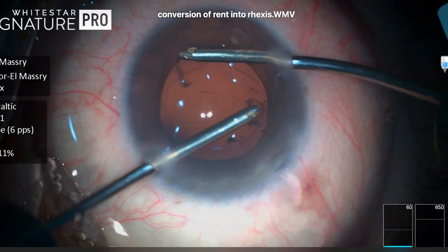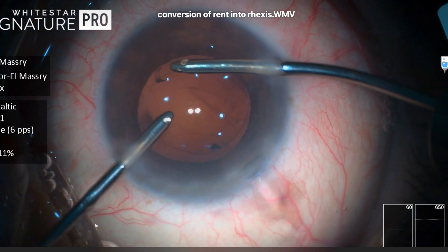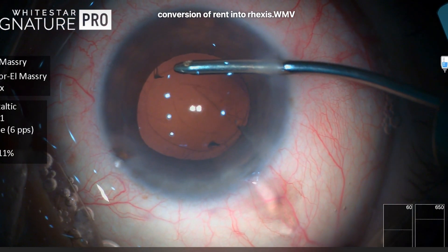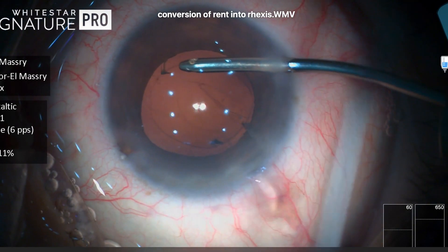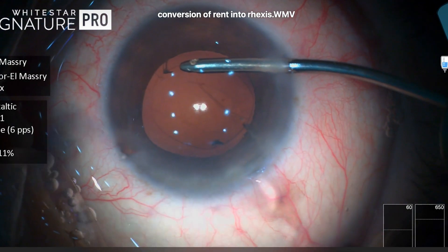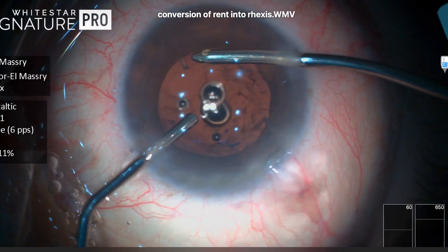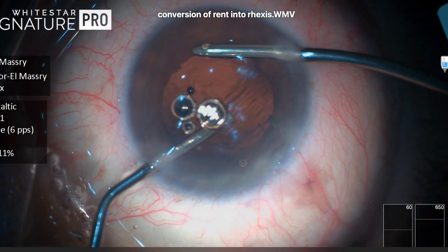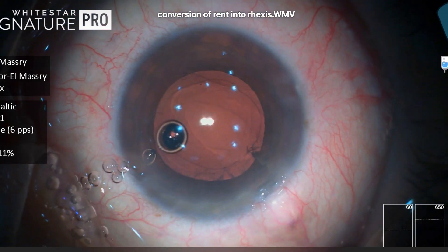It's not that obvious at first, but now it's obvious that there is a rent or a tear in the posterior capsule. So the first thing to do is to direct the irrigation upwards so that the current is in the anterior chamber, not pushing any fragments into the tear. Then I'm putting viscoelastic with the other hand, closing the irrigation, and removing the irrigation cannula outside.